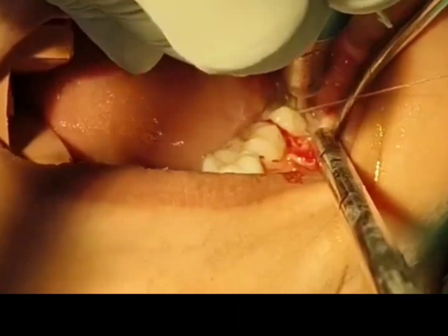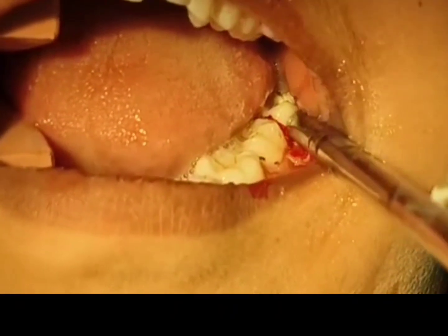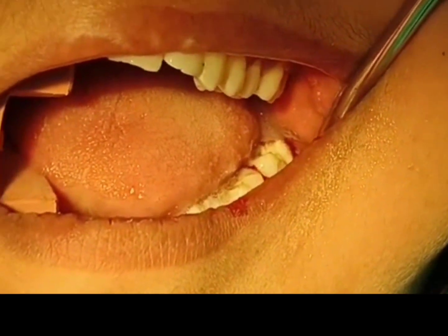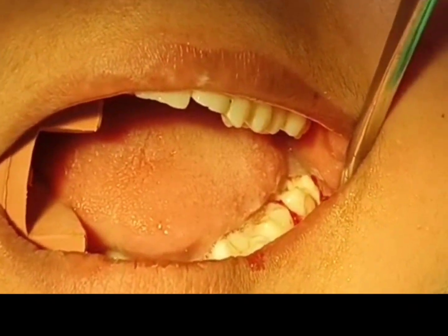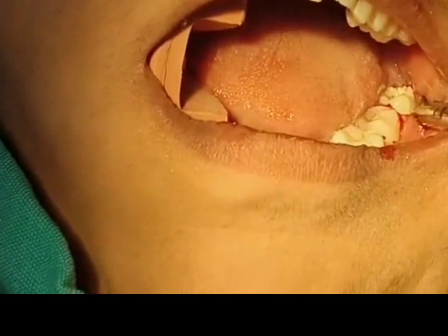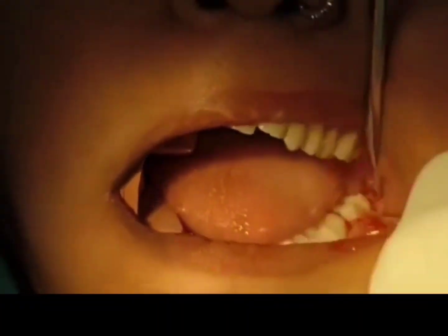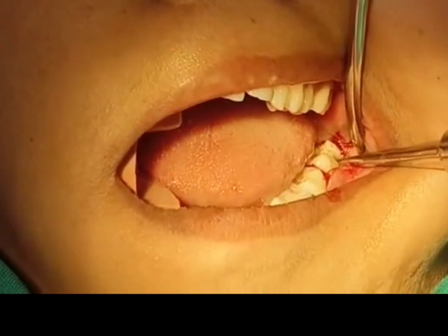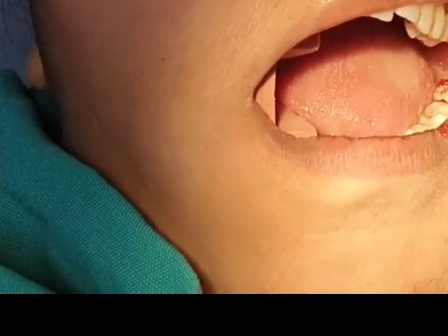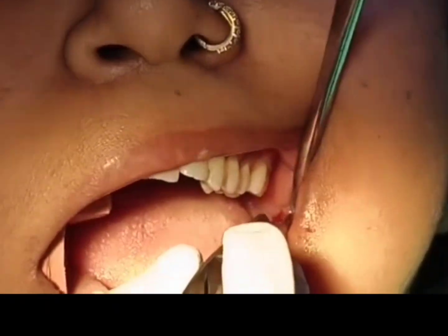Second, even if we have diagnosed it correctly and have prepared everything for surgical approach, the surgery itself is not easy. The path of removal of a distoangular impacted third molar in mandible is towards the ramus and external oblique ridge. There is no space for its removal. We need to create adequate space by distal crown sectioning and buccal groove preparation. Now for this, angulation of the micromotor and bur is difficult in this region, particularly if the patient does not have a good mouth opening.